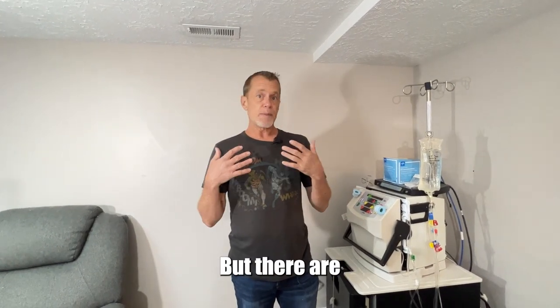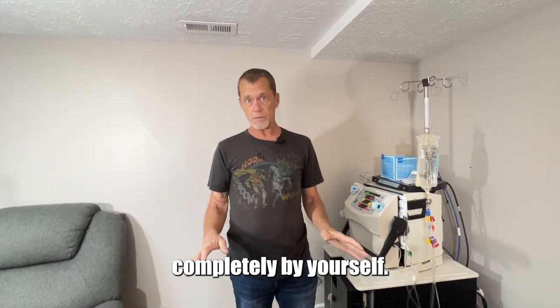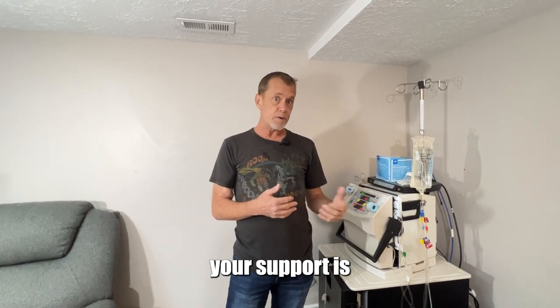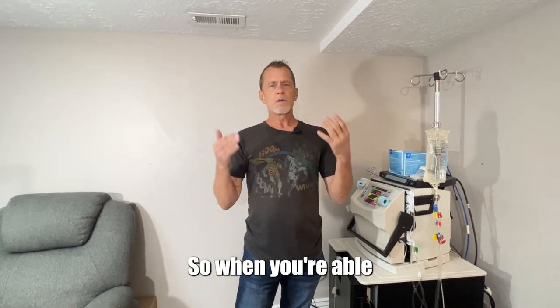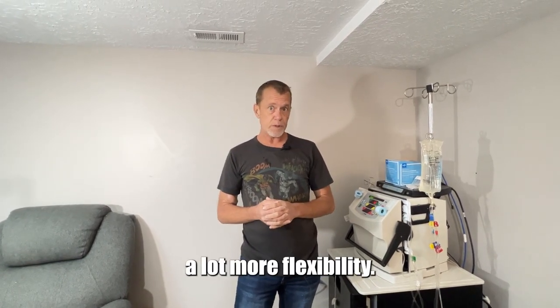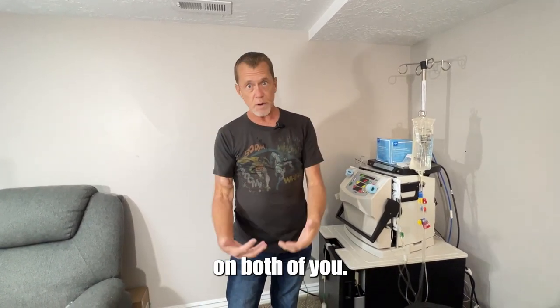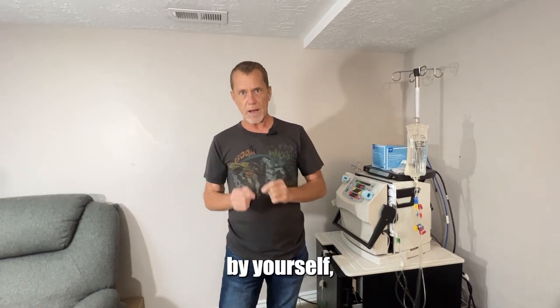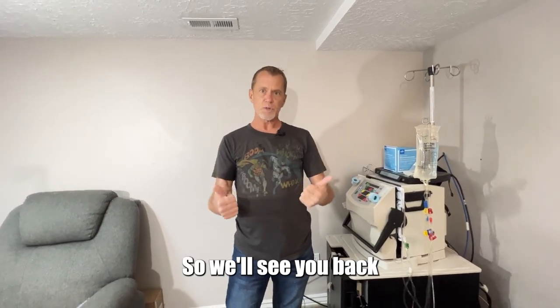Most people have a care partner, and I have a care partner. But there are, in some states, at some clinics, you are allowed to do dialysis completely by yourself. And even though I have a care partner, burnout for your care partners and support is a real thing. It's easy for us to get burned out, and it's also easy for our spouses and care partners to get burned out. So when you're able to learn to put yourself on and take yourself off, it gives you a lot more flexibility and allows your spouse to take a break. There's less burnout and fatigue on both of you. That's what I'm going to show you — how to do this by yourself, including cannulating yourself, taping, and connecting to the machine.